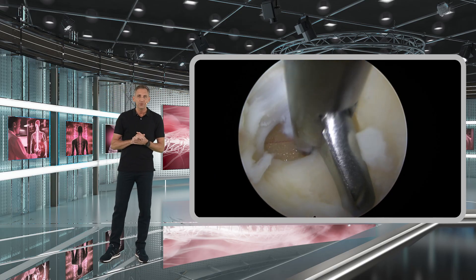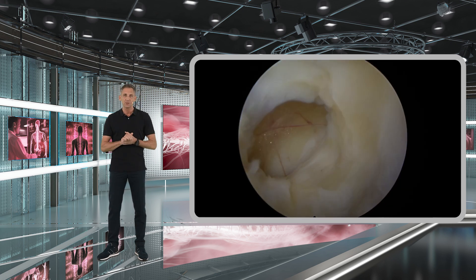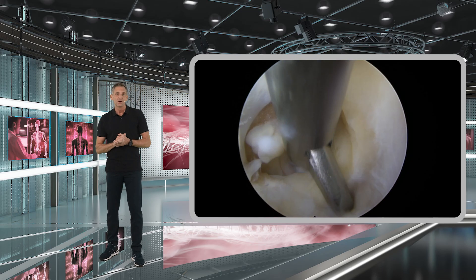From here on you can continue to remove the yellow ligament either with the scissors or with the Kerenson rongeurs, slowly going layer by layer from medially to laterally.